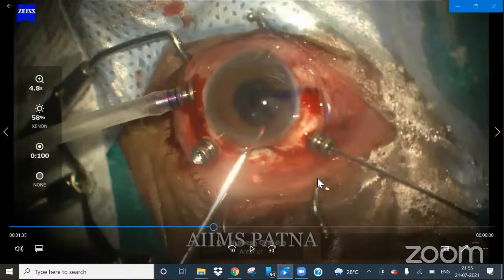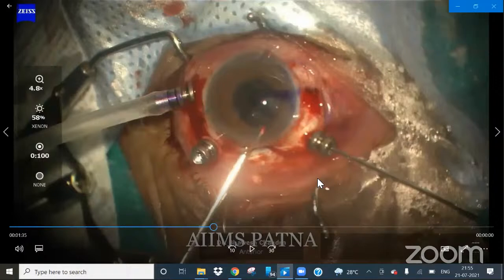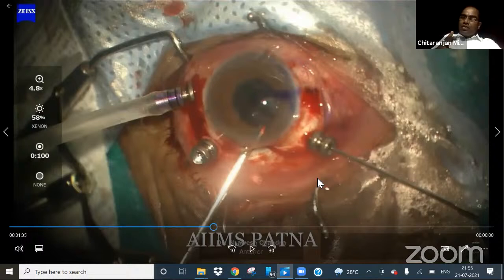If we are going to implant a foldable SFIOL, then only we can go through a limited length tunnel. So in that case, even if we are planning to cut, we'll cut it in the anterior segment only, in the anterior chamber only. Then we can engage the cut half of the optic, slightly rotate it and take it out. That is one option. But if we have a big sclero-corneal tunnel, in that case there is no need to cut it. So if at all we are going to cut it, then it will be in the anterior segment, and we have to engage it, rotate it and take it out.